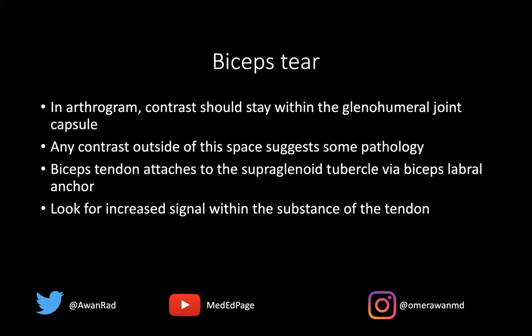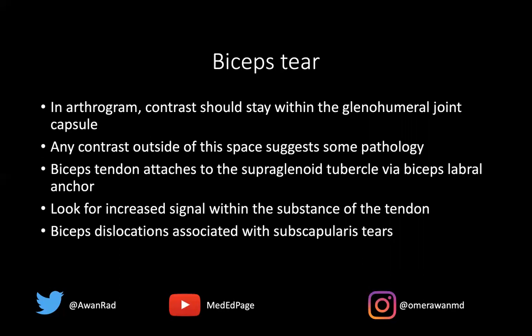You always want to look for increased signal in the substance of the tendon — that manifests as a tear. You also want to make sure the biceps tendon is not dislocated. Normally, the biceps tendon sits in the bicipital groove between the greater and lesser tuberosity, and it can often be dislocated from that groove. Biceps dislocations are associated with subscapularis tears — this is an ABR favorite on the core exam. The transverse ligament helps situate the biceps tendon in the bicipital groove, but some of its fibers come from the subscapularis tendon. So when there's a dislocation, oftentimes the subscapularis tendon tears as well.